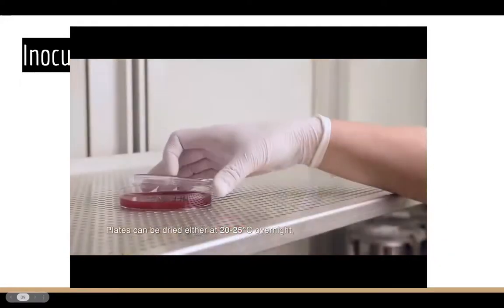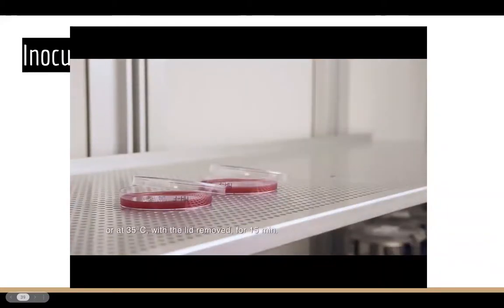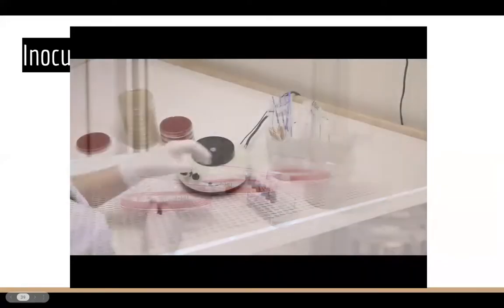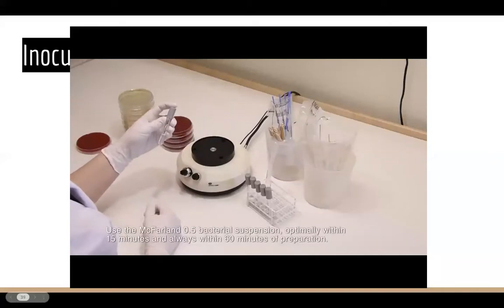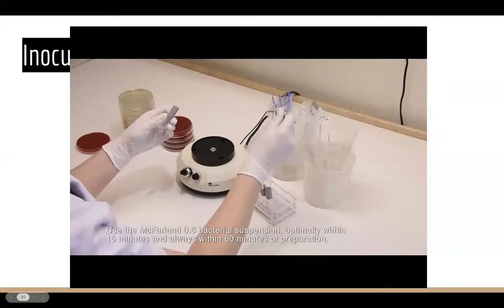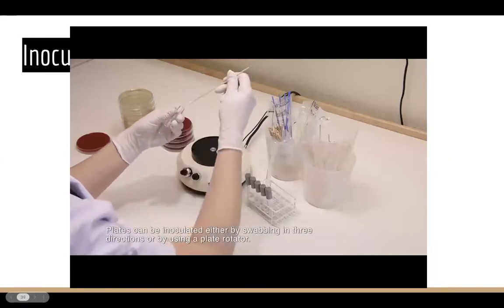Plates can be dried either at room temperature, 20 to 25 degrees Celsius, overnight, or at 35 degrees Celsius with the lid removed for 15 minutes. Use the McFarland 0.5 bacterial suspension optimally within 15 minutes and always within 60 minutes of preparation. Plates can be inoculated either by swabbing in 3 directions or by using a plate rotator.